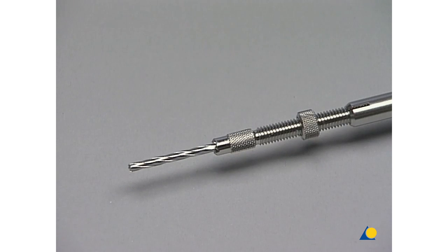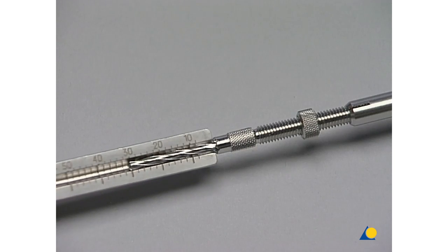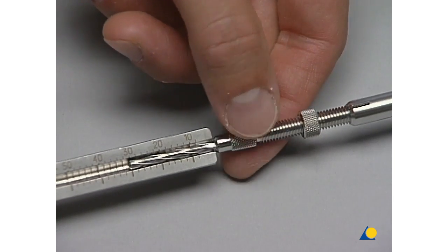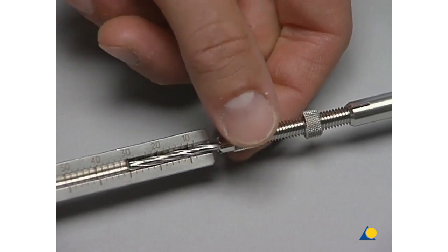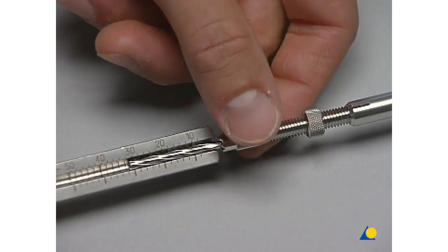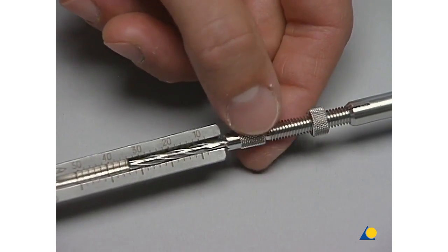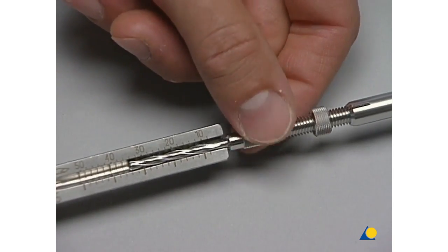The length of the part of the drill bit protruding from the drill guide with stop is checked with the direct measuring device, and the required drill bit length is adjusted by turning the insert. The drill bit should be set at a length of 1 to 2mm shorter than the determined screw length.